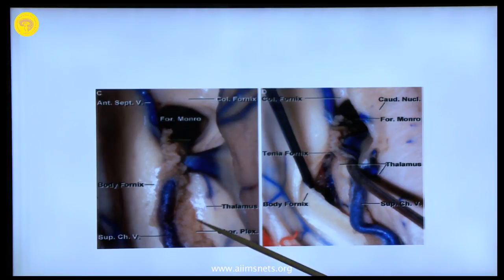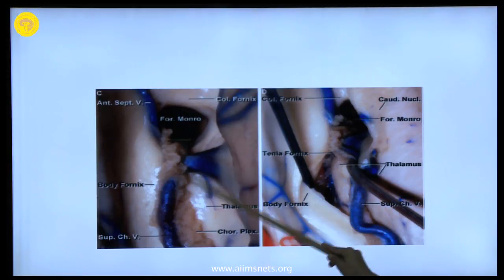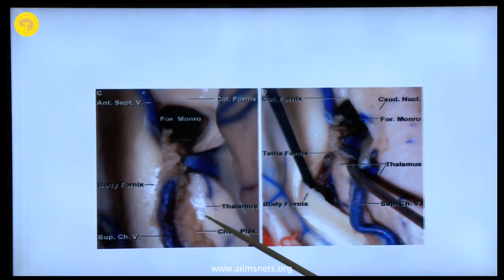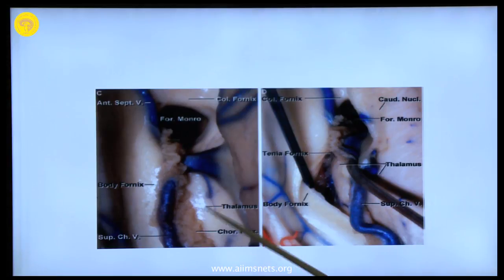This is attached here — this is the lateral ventricle going to the third ventricle. You have to dissect here, you have to retract this choroid plexus and then go, but most of the time we are not using those approaches.